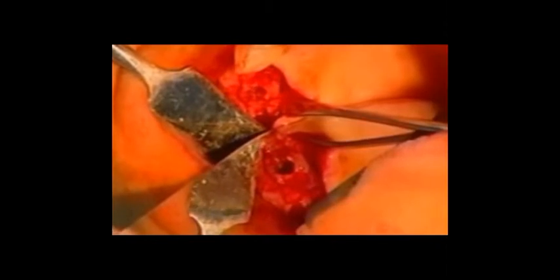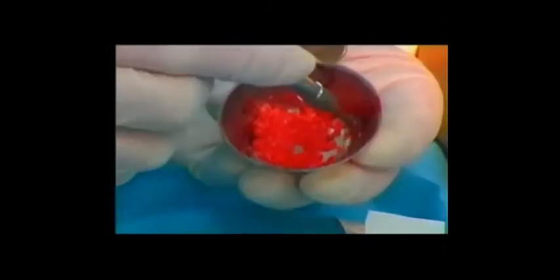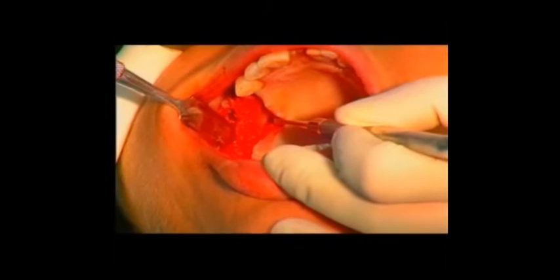This now enables the continuation of the augmentation by bone substitute injection. Bone substitute Bio-Oss is mixed with saline in fresh blood, inserted into the dedicated bone graft injector, and injected into the osteotomy under the antral membrane. A periapical x-ray is taken to verify the density of the bone fill.